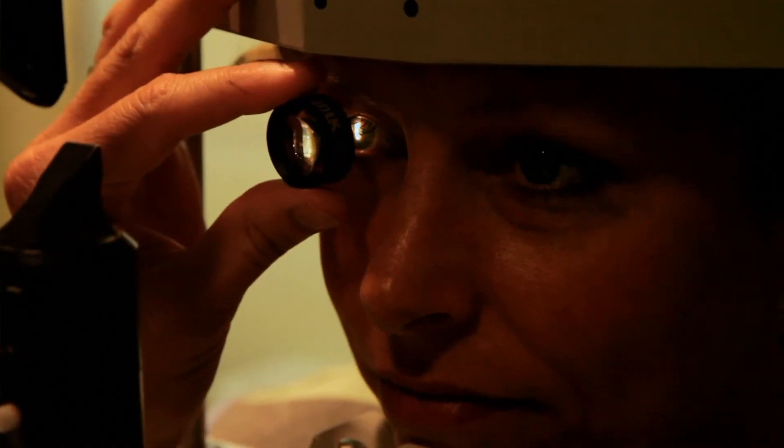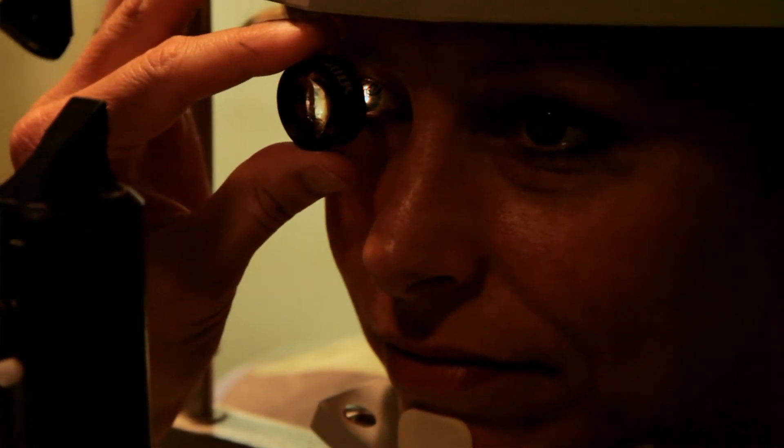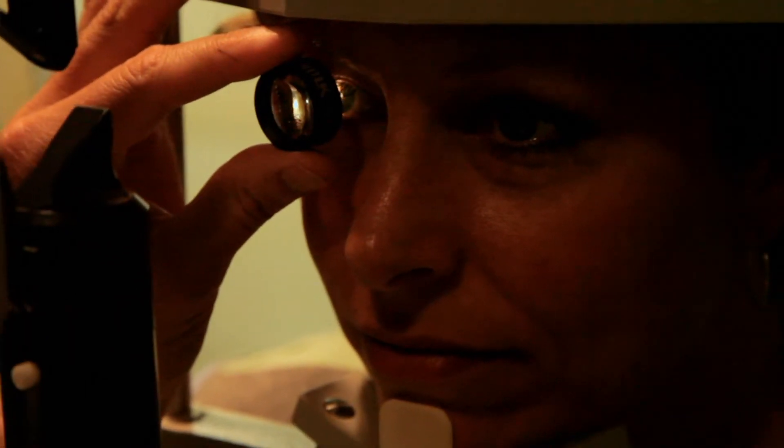Then folks will have their pupils dilated — a drop will go in the eye and the pupil will get very large. After that's done, the doctor can look in there with a little magnifying glass to see if the optic nerve and retina look healthy. The first magnifying lens is a small handheld one used at the slit lamp microscope, giving a highly magnified view of the optic nerve and the macula.